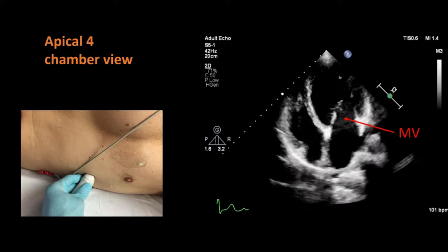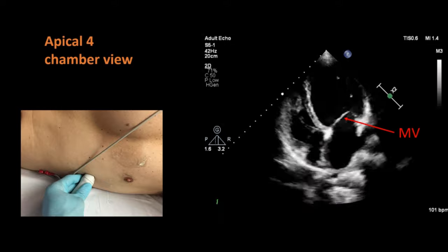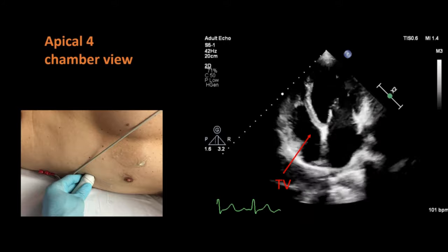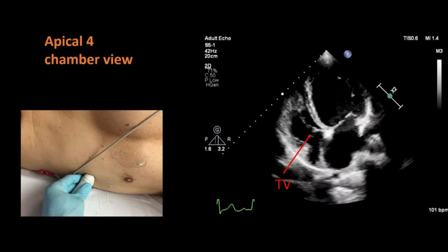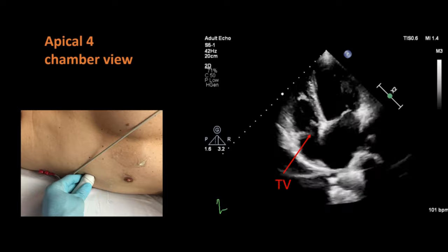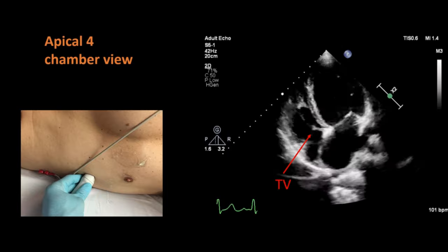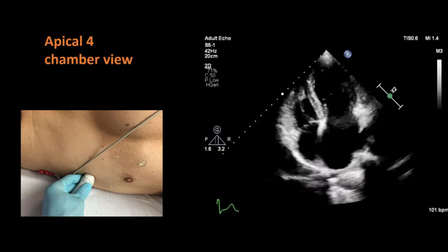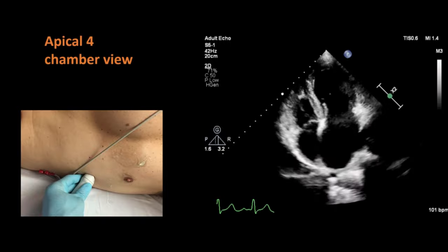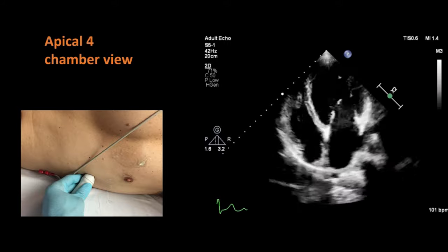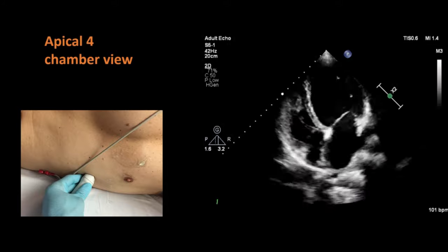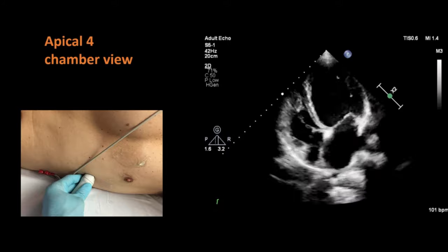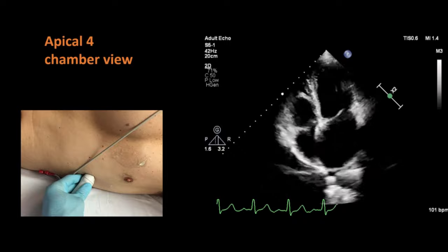Between the left atrium and left ventricle there is a valve which has two leaflets and is known as the mitral valve. Similarly, between the right atrium and right ventricle there is a valve which has three leaflets and is known as the tricuspid valve. In this view we comment upon the size of the chambers and functions of the mitral and tricuspid valves. We should look for any defects in the inter-atrial or interventricular septum, and we can also visually assess the systolic function of the left and right ventricles.